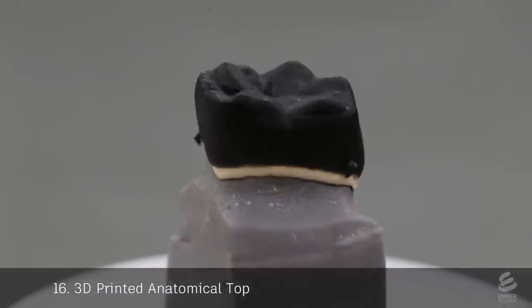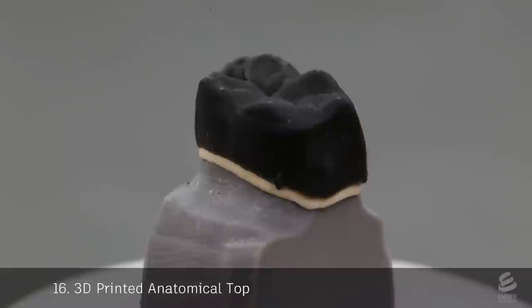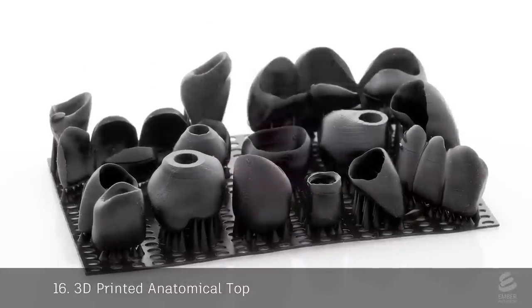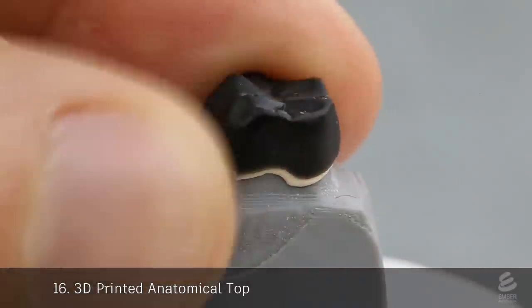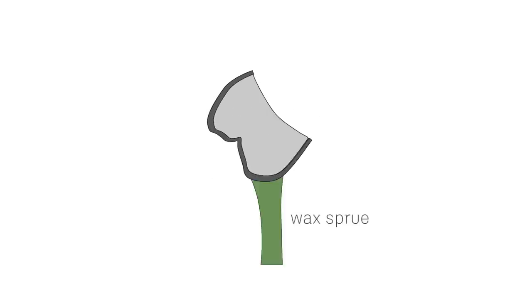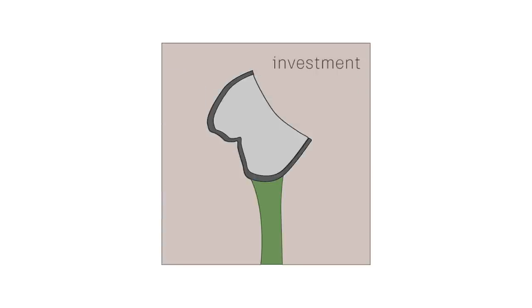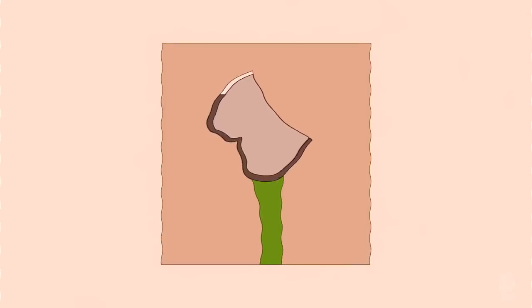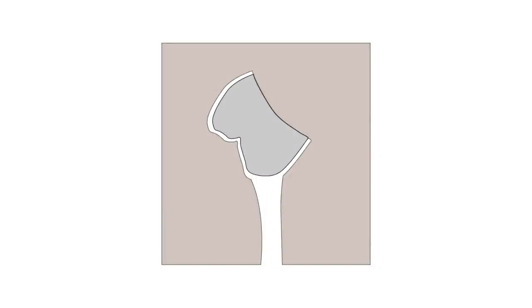To create the porcelain layer, an anatomical top is first 3D printed on Ember in castable resin. The top slides onto the opaque casting. The casting and top are then attached to a wax sprue. The part is surrounded again with liquid investment. After it solidifies, it's put into an oven where the wax and 3D printed top are melted out, leaving the metal coping embedded inside the investment.